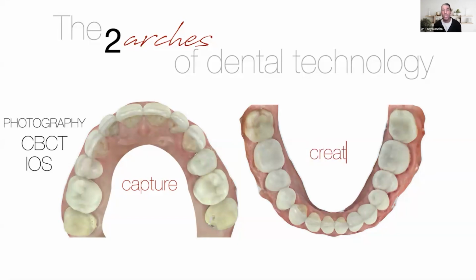And then the second arch, the mandibular arch, is create. That is taking all that data that you captured and making something out of it, either milling or 3D printing or something where you're actually creating something physical for that patient.